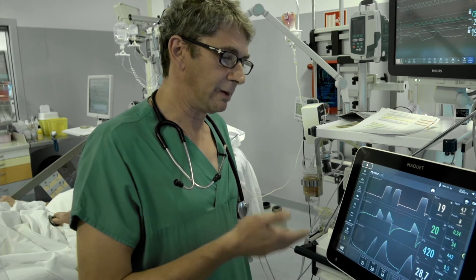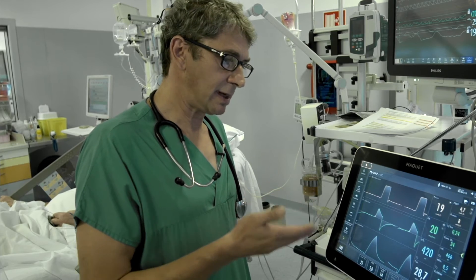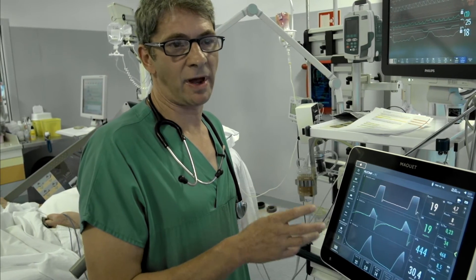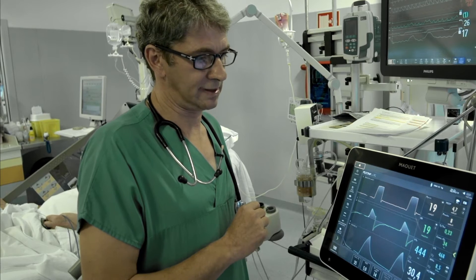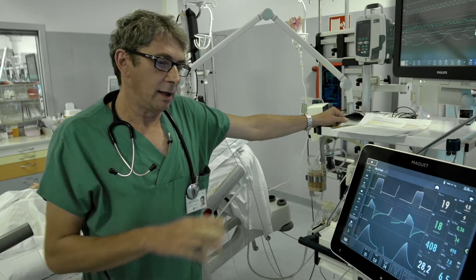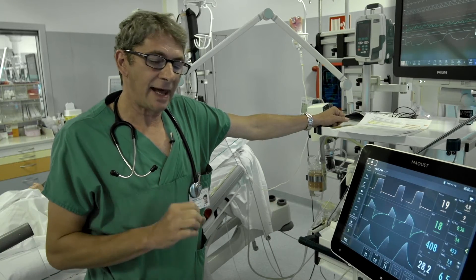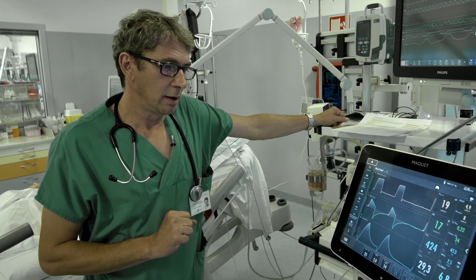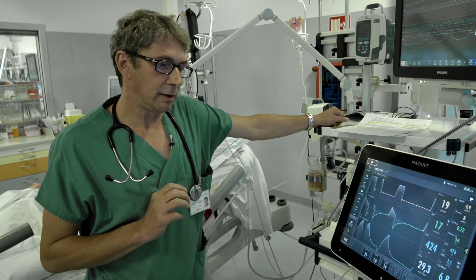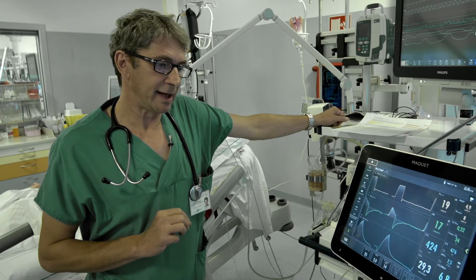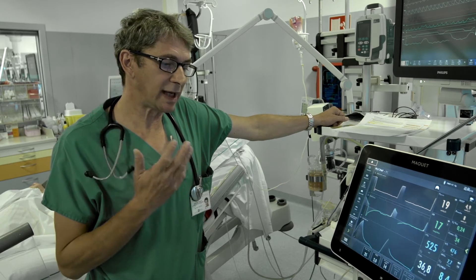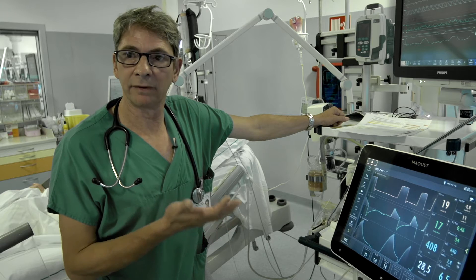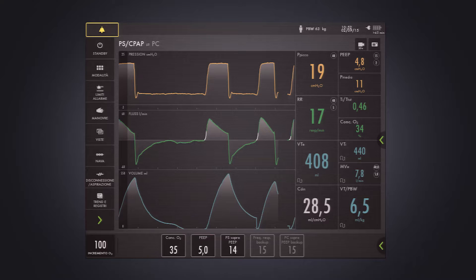The patient looks adequately ventilated with these parameters of assisted ventilation. Even the blood gas analysis is okay with this ventilatory setting. But the true problem is: what can we say about diaphragm activity on this ventilatory setting without EDI?